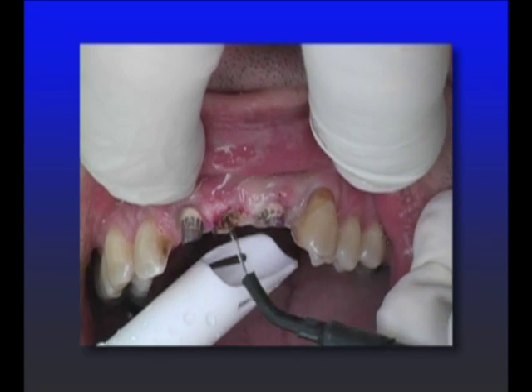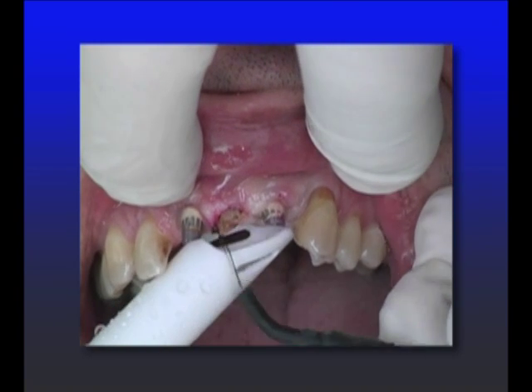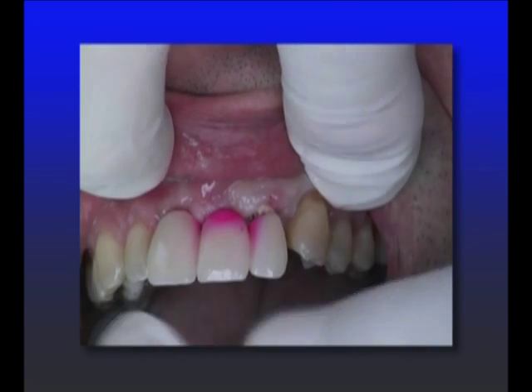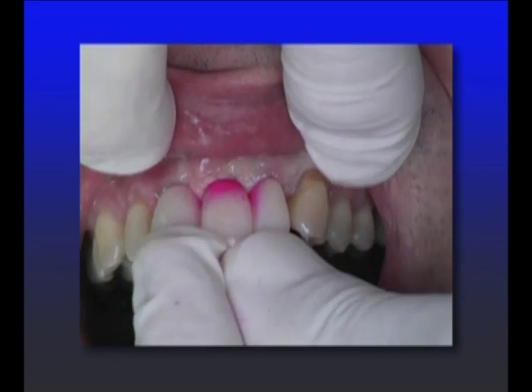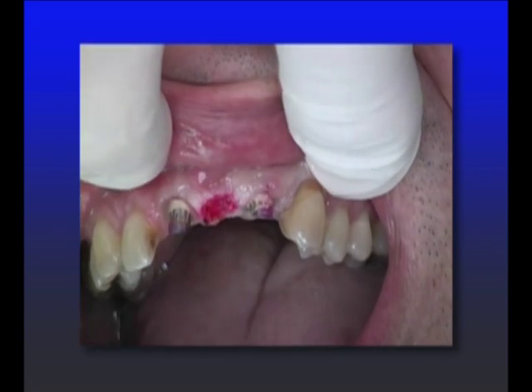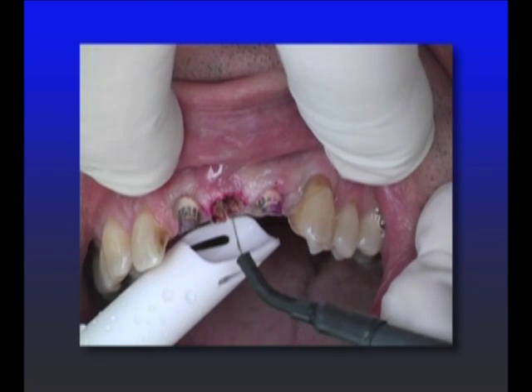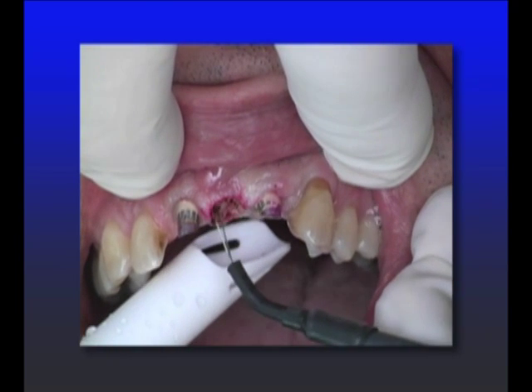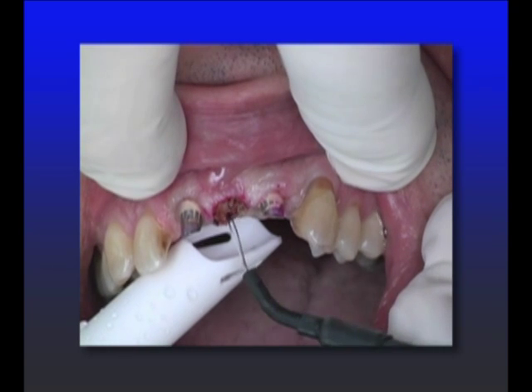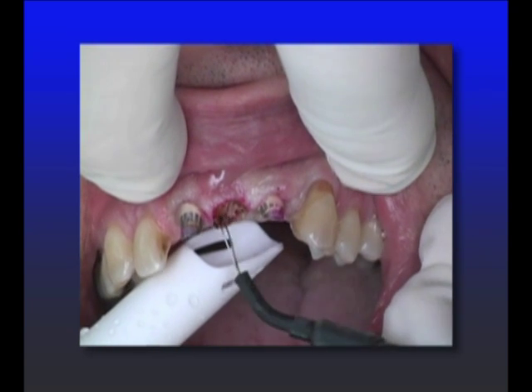What I'm looking for is to get the bridge in with minimal pressure on the ridge. I don't want to watch that bridge push that pontic tissue apically. I want the tissue to basically sit still while the bridge fits up into it. And it's just a repetitive process of carving, trying it in, carving, trying it in, until the bridge goes in with minimal movement of the tissue — and then we can cement it.